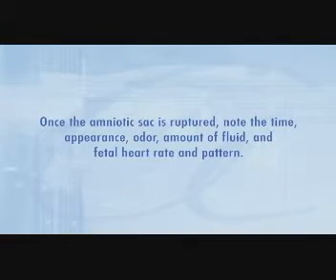To assist with artificial rupture of membranes, stay with the client. Once the amniotic sac is ruptured, note the time, appearance, odor, amount of fluid, and fetal heart rate and pattern. Document this information in the client's chart and on the fetal monitoring strip.